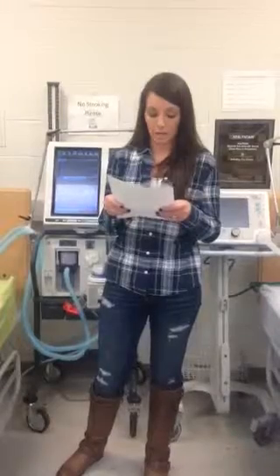After the rate change, I will titrate the FiO2 down to 33%. I decided to wean the FiO2 in small increments due to her sensitivity to oxygen changes. I will maintain her pressure support at 5 and her PEEP at 5. This will allow her to overcome the resistance of the ET tube and take optimal breaths.